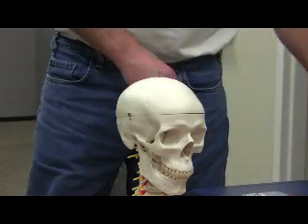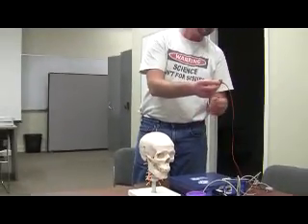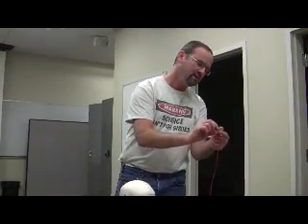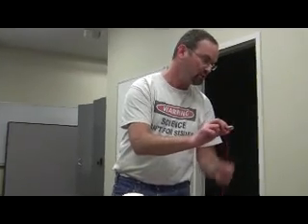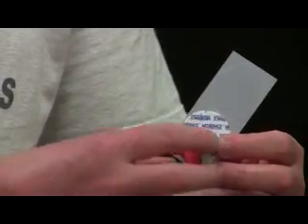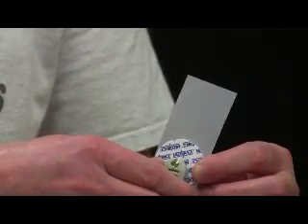Each one of these electrode leads is equipped with a little lobster claw mechanism. There's a little notch, and if you squeeze on it, you open the lobster claw just a little bit, and when you close it down on the metal post it just grabs onto it. If you've done it right, it will grab hard enough that it won't come off easily, but it'll also rotate around, which allows you to reposition the leads for subject comfort.